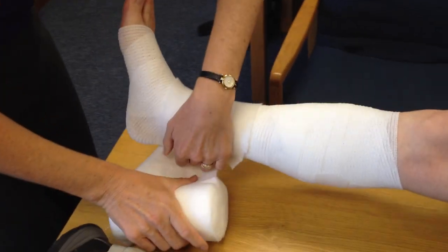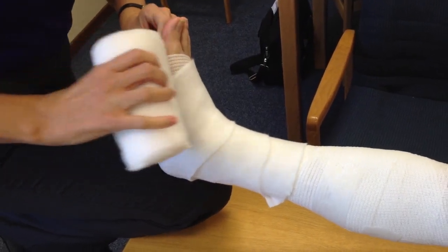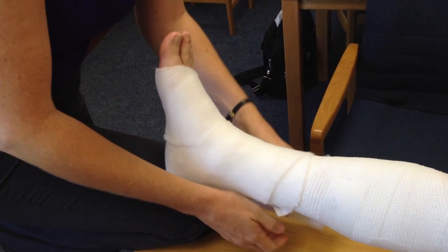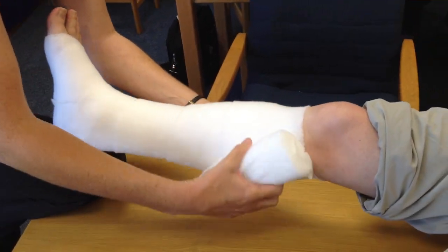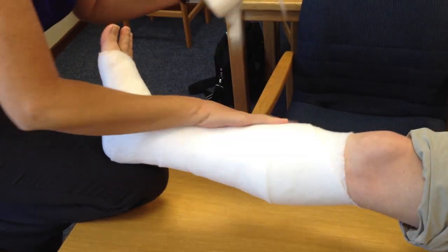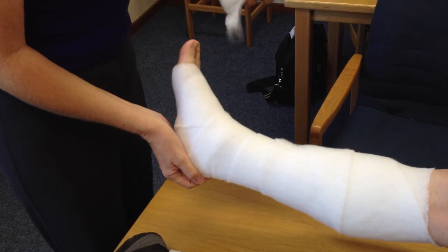Again I start at the ankle and do exactly the same thing — over the heel to the base of the toe. Allow the roll of orthopedic wool to go where it wants to go; it will go to strange places depending on the individual leg. Notice the heel is left relatively uncovered — not too thick on the heel — because patients in compression want to be able to have their shoes on.